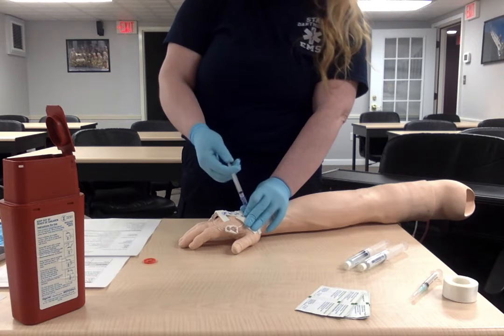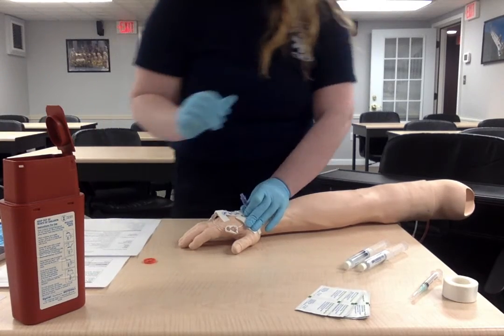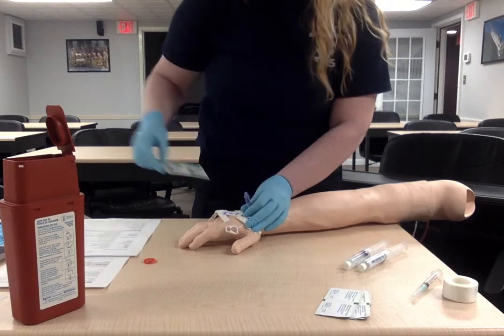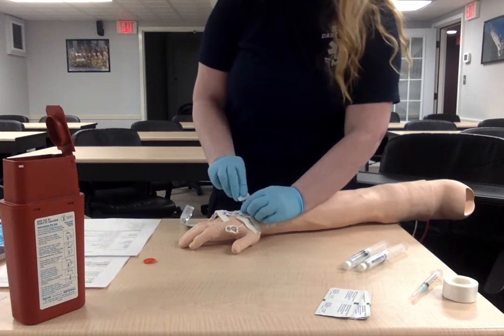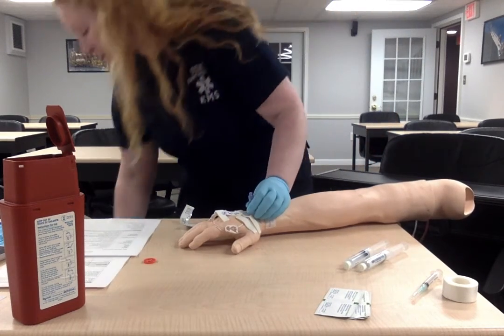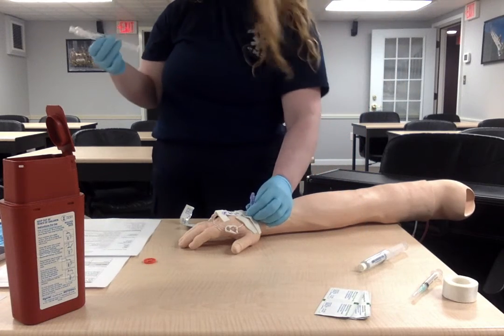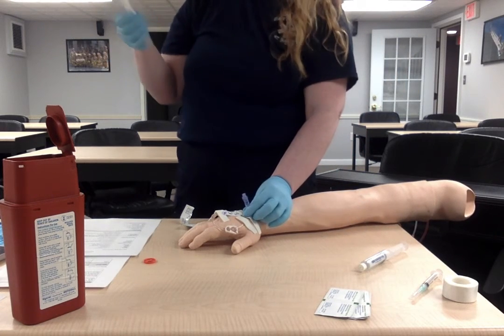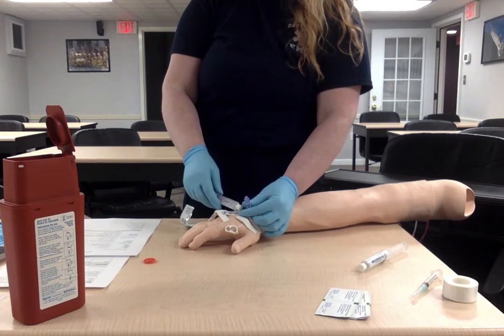Okay, so we have the full amount in. We're going to disconnect the medications, dispose of that. We're going to take another alcohol prep pad, clean that port again for roughly a minute, and let it air dry. While that's air drying, we can take our second normal saline dose. Again, we're looking at this to make sure it's not expired, that there are no particulates in it, that it's normal saline, everything we want through that.